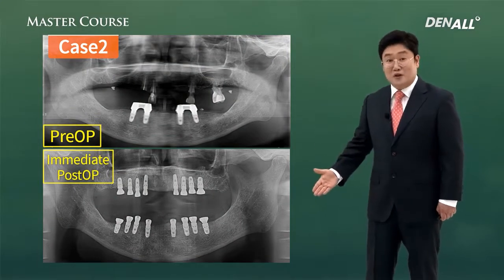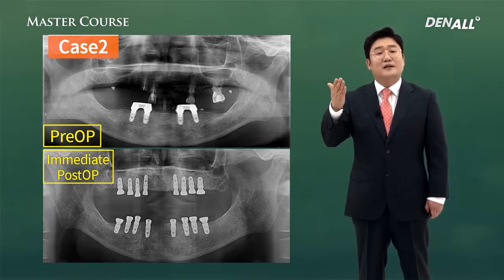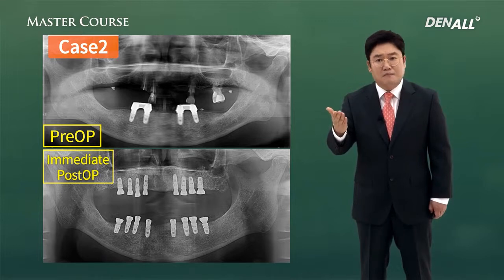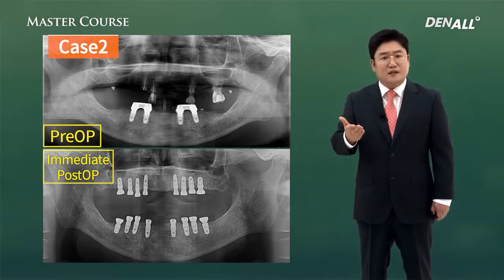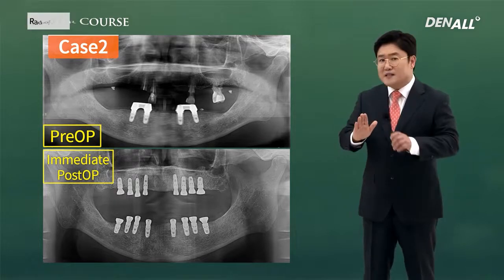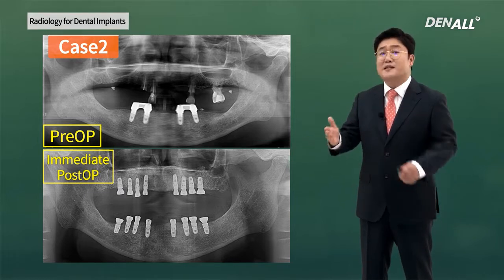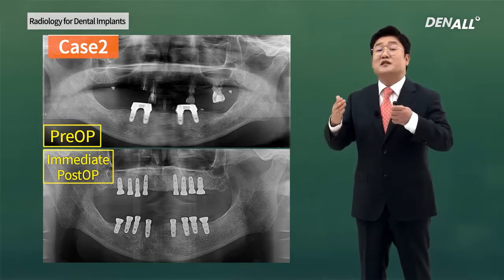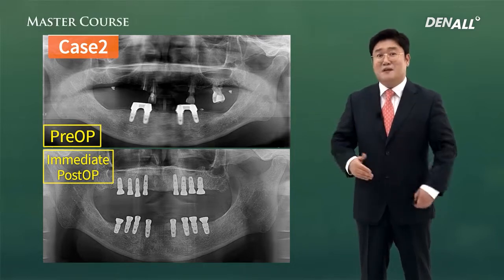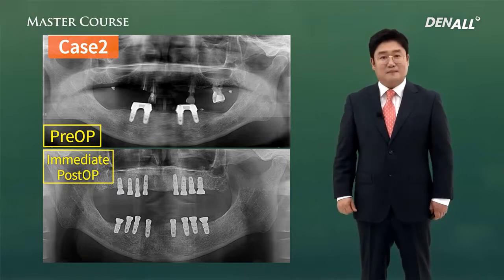If you compare pre-op and post-op, such a digitally guided implant surgery, what enabled that? Right, CBCT or cone beam CT made it possible. Without that, this guided surgery cannot be performed. The advancement of CBCT led the development of implant surgery. Thus, CBCT is a very important radiological procedure.